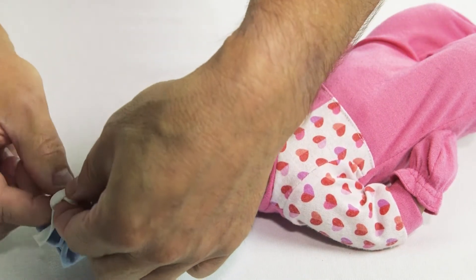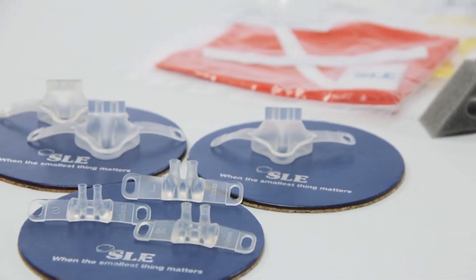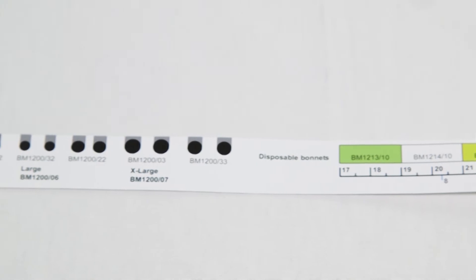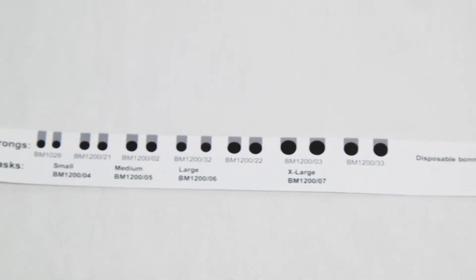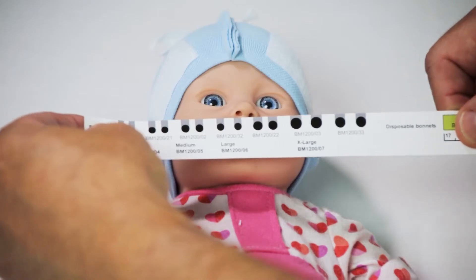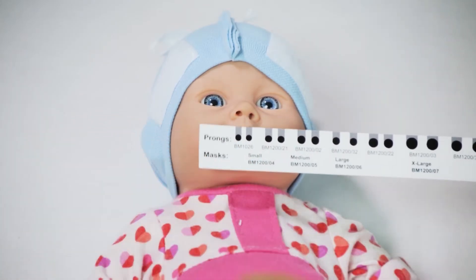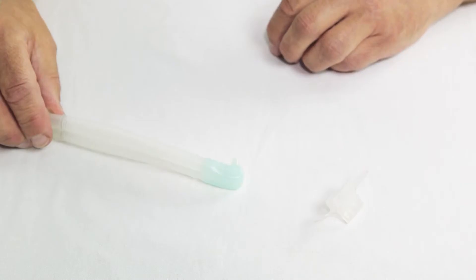You can use either a mask or prongs. If you are using prongs, there are graphics on the side of the measuring tape to help you find the right size. Just hold the tape under the baby's nose to measure the size and width of the nostrils. In this case, we have decided to use a mask.